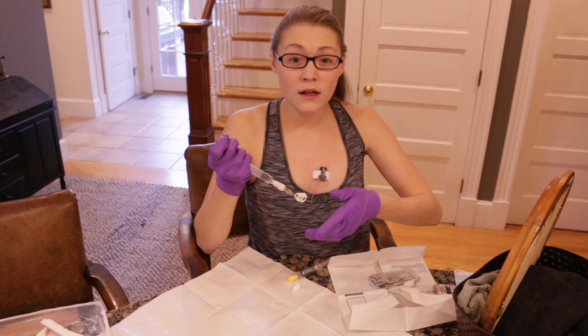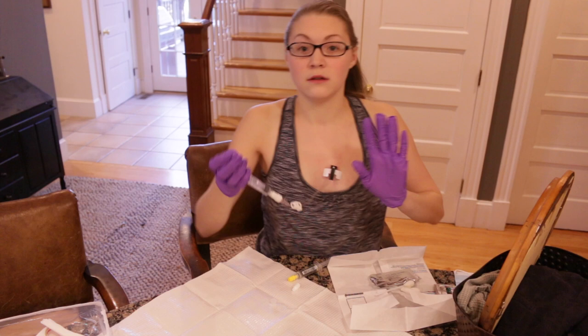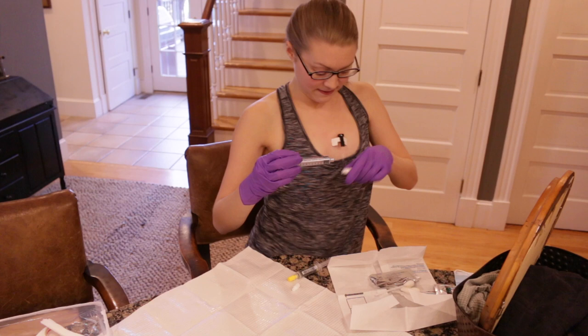As you can see, it's flushing well. It's not stiff or anything. I've flushed the whole saline syringe in. I'm going to go ahead and disconnect that and just let the tube hang, because I'm not going to need to touch that again. Discard that.